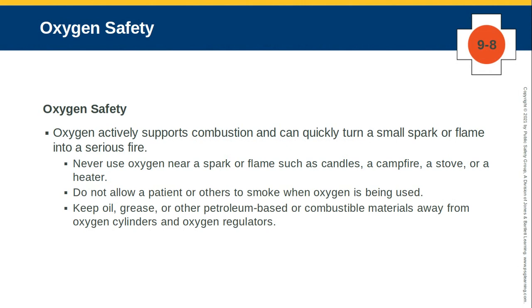Now, oxygen safety comes down to two things. First of all, understand that oxygen is not flammable in and of itself, but it supports combustion. So if you are near some sort of a fuel, we need to be careful with the administration of oxygen. That's why we shouldn't allow a patient or bystanders to be smoking, because that would be the ignition for any sort of combustible material that's nearby.